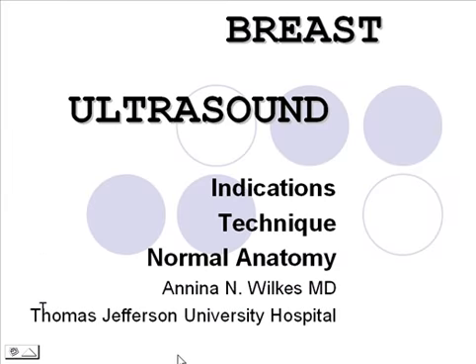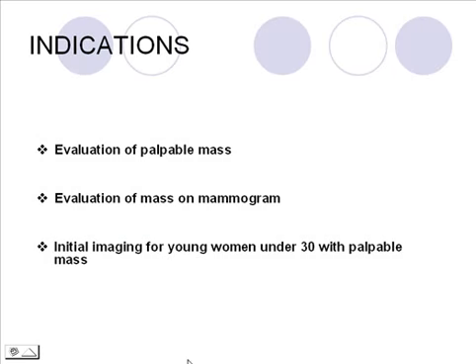Breast ultrasound, indications, technique, and normal anatomy. We use breast ultrasound most commonly for evaluation of a palpable mass.